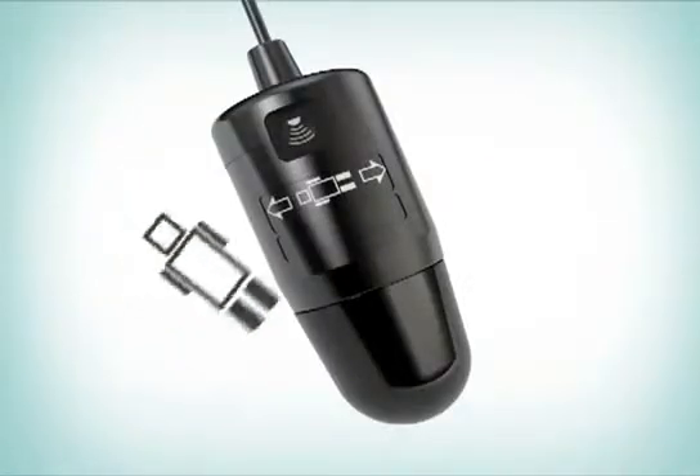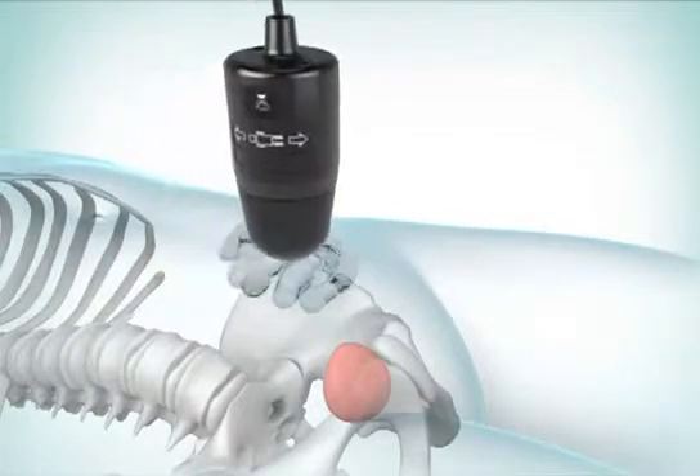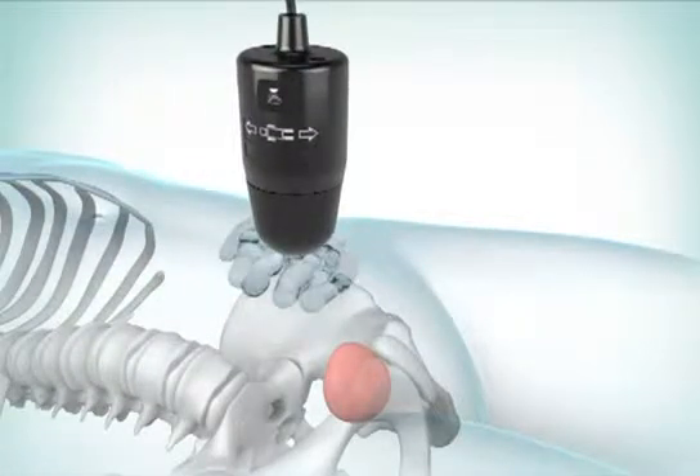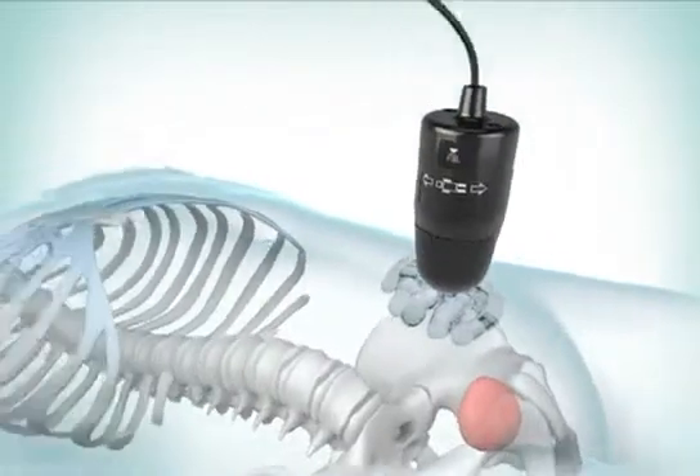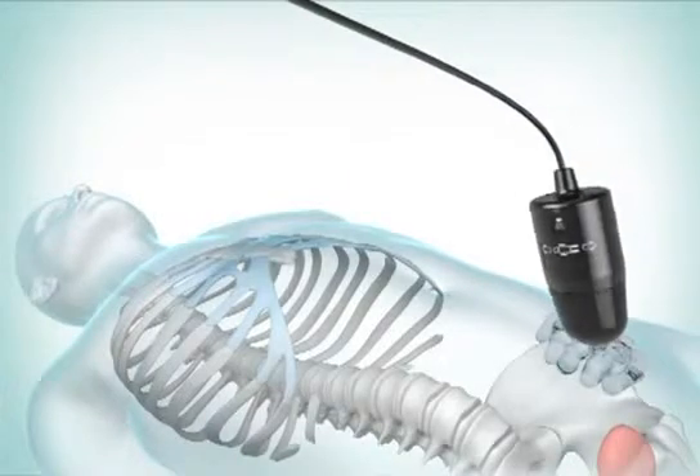Locate the patient icon on the probe. Make sure that when the probe is placed on the patient's abdomen, the head of the icon points toward the head of the patient. Place the rounded end of the probe on the ultrasound gel and aim it toward the expected location of the bladder. For most patients, this means angling the probe slightly toward the patient's coccyx.